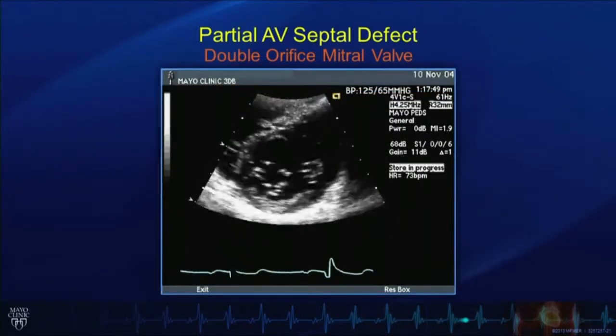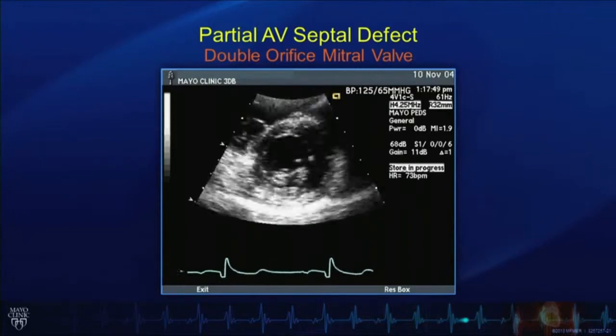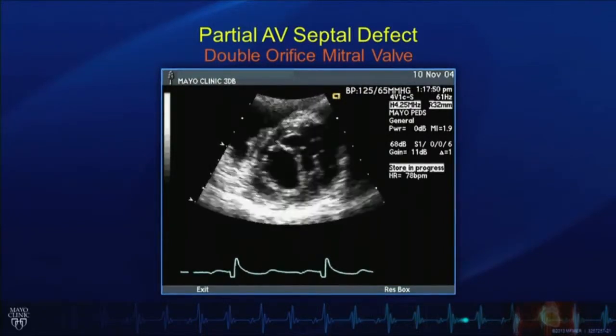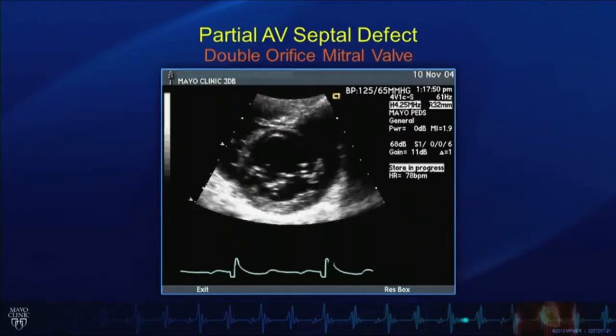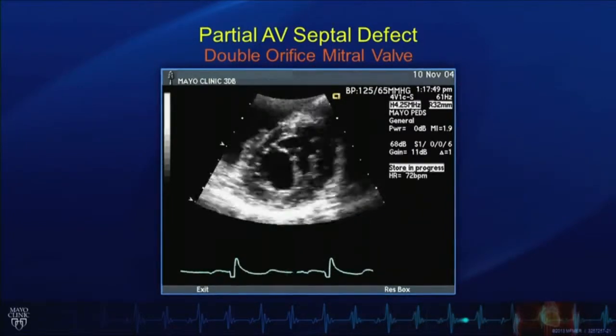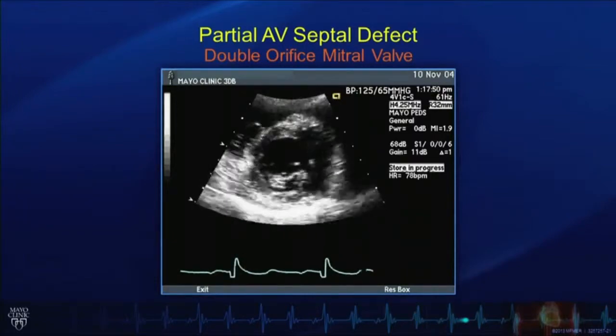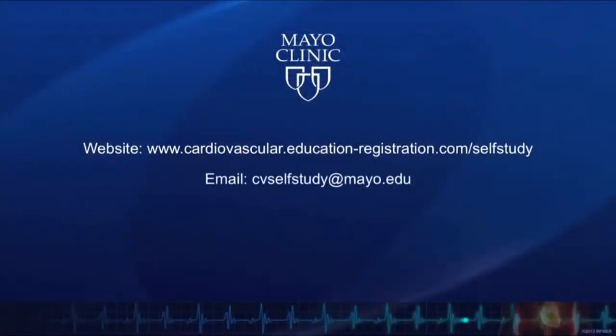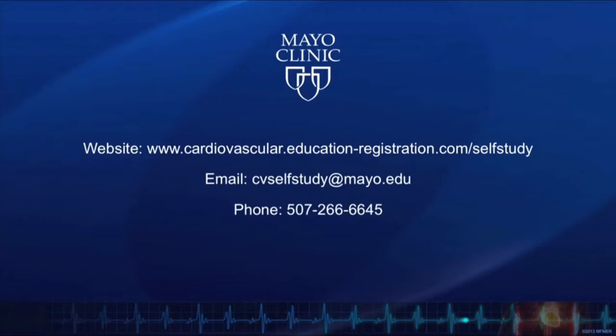Here we have an image of another associated abnormality — a double orifice mitral valve — which can also be seen in patients with partial atrioventricular septal defects or primum atrial septal defects. You can see the two orifices of the mitral valve. For more information on other programs in the Tutorials in Echocardiography series and other educational series, please visit our website or email us at the information shown on the screen. Thank you for joining us.